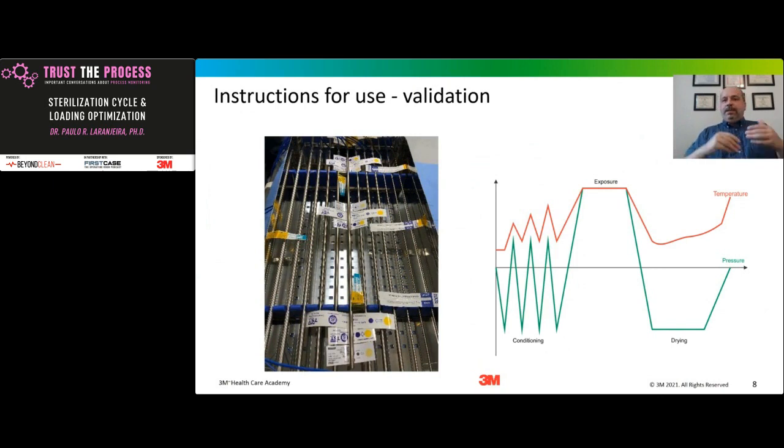And I started doing research. This is part of one of the studies that I published. So I tried to reproduce and see the condensation and how to improve the cycle. And in this moment, I was only working with the medical device that I had that created a challenge.